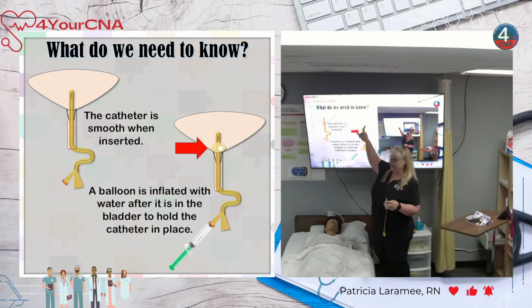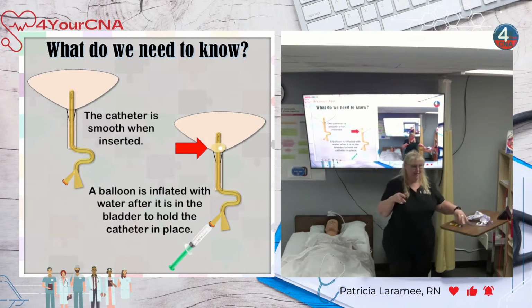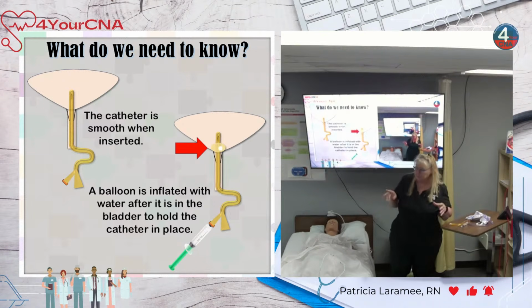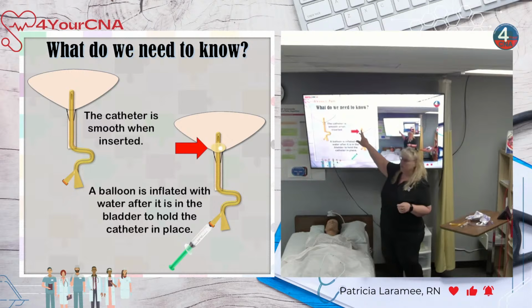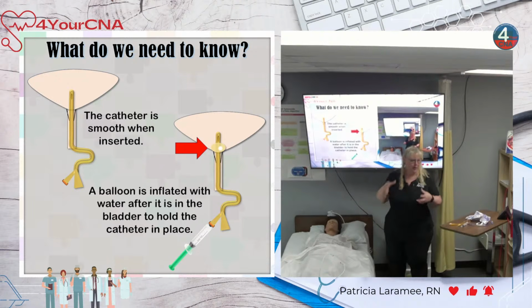It's actually here in the bladder. Because in a small percentage of people, like less than 2% of people, when you put a catheter in, and because we have this bladder empty, it's compressed, it's small. So the tip of this catheter hits the top of the bladder. We're keeping the bladder small. So the tip of the catheter hits the top of the bladder.